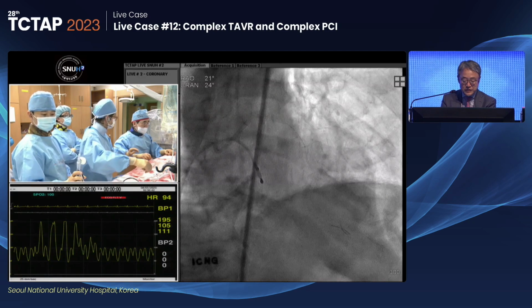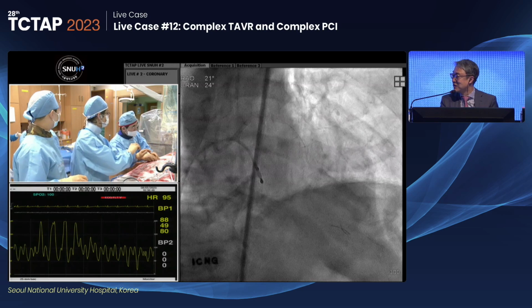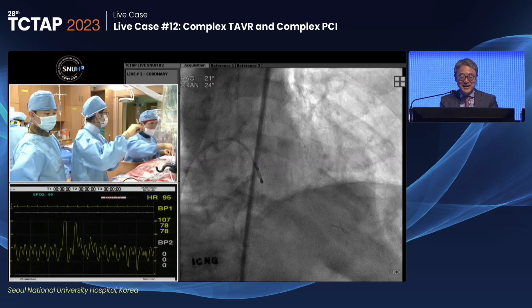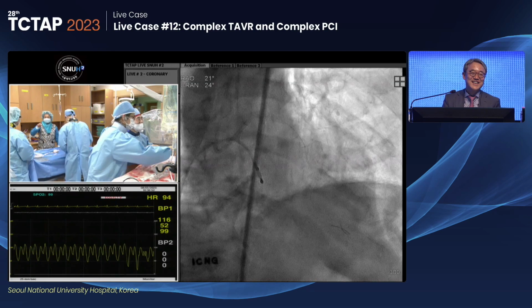Yes, you know this time is limited, but this last case, many people crowded this room and want to watch it more. Yeah, we keep going.